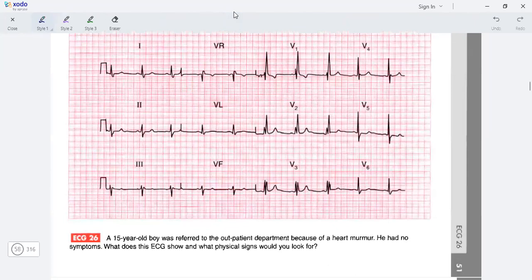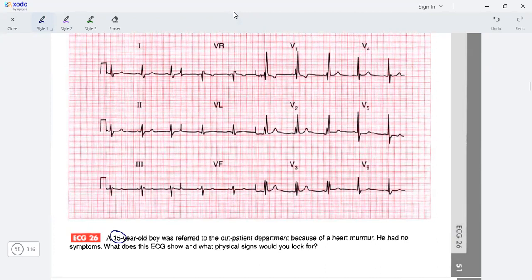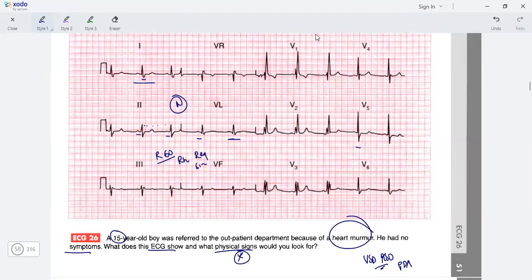Next is a 15-year-old boy with heart murmur, could be a VSD or ASD or PDA, no symptoms. The rate is around 60, normal. Rhythm is regular and sinus. Axis is normal. 2, 3, AVF is all right. 1 AVL has some slurring. V5 V6 show some ST depression. V1 to V4 show the RSR pattern.